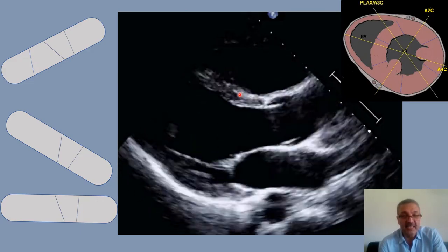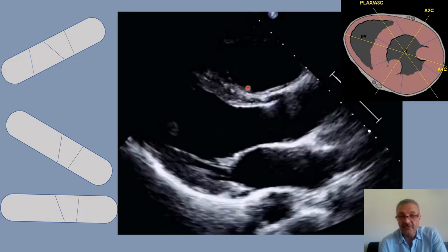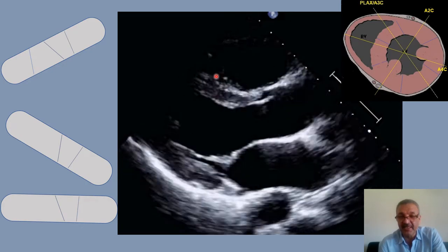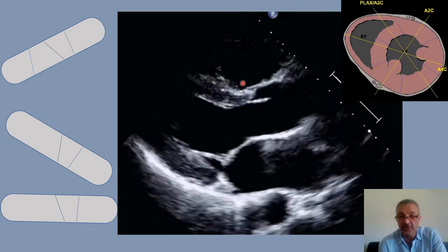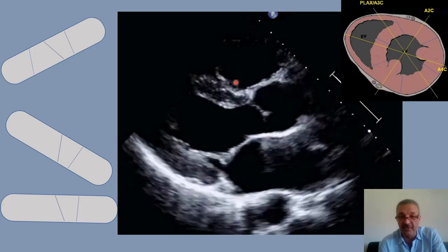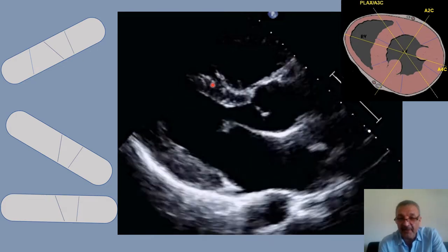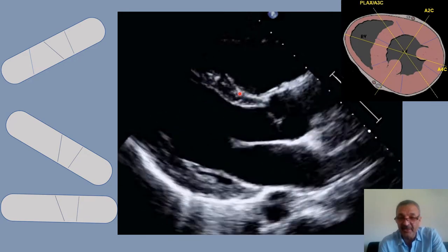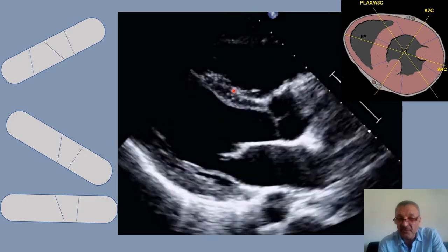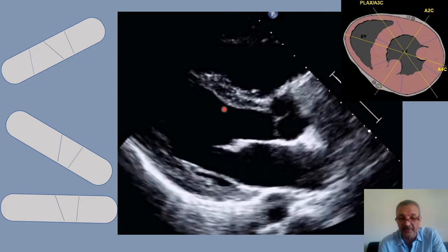Another point: at the septum, if you notice trabeculation — irregular indentation on the right ventricular side — do not include that in your IVS measurement. If you look carefully, you see a hyperechoic line at the right ventricle side of the IVS. That is your border where you place your marker and measure from there to the endocardium.